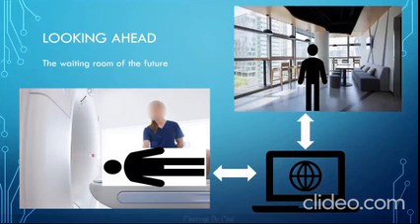But with the integration of AI, computer-aided detection tools could help to pre-screen routine exams for incidental, emergent, and clinically actionable findings. As opposed to the workflow shown in the previous slide, in this example, the patient would receive their exam, and while the images are being processed, they are also being sent to an AI server. While the exam is being processed in the AI server, the patient would be sent to the waiting room while their exam is being analyzed by the AI for emergent incidental findings.